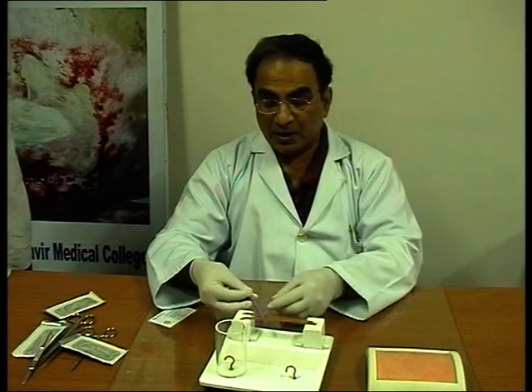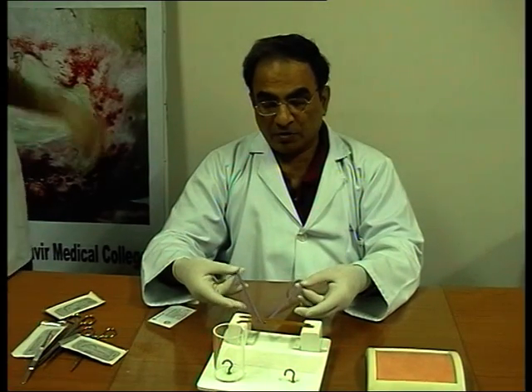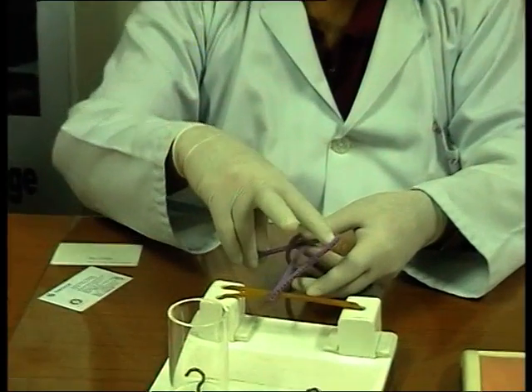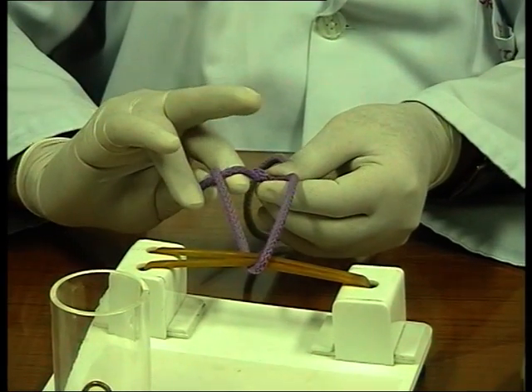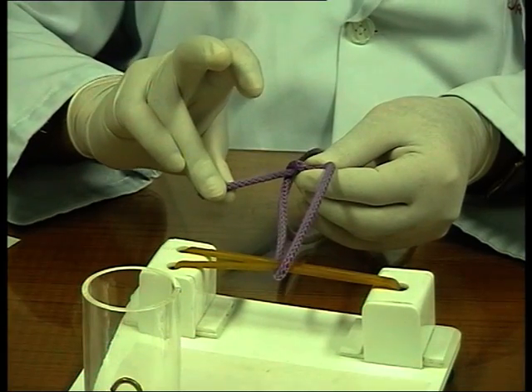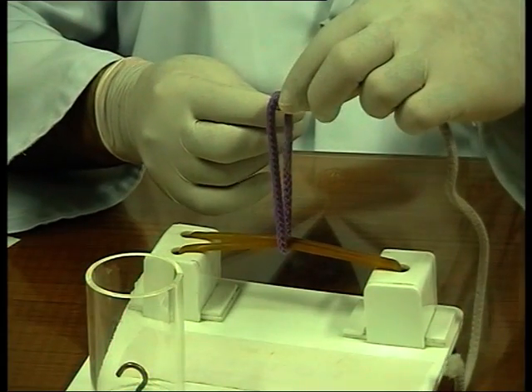Index finger throw, like we did for the reef knot, is the same. Holding the thread between the thumb and the ring finger, drawing this out like a figure of 4, holding the end section, using the index finger to fish out this thread once, holding it back again, fishing it out a second time, and crossing.